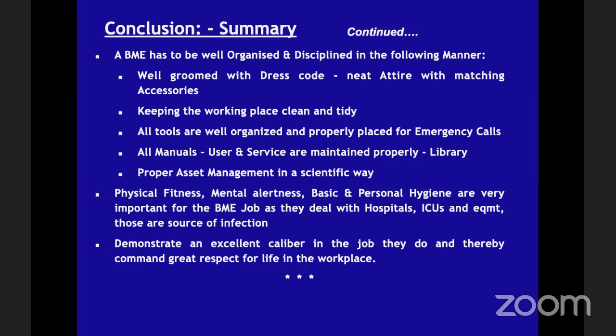Keep the workplace clean and tidy. In 90% of cases, I have not seen a tidy biomedical department. You open the department, there are cables and tubes on the floor. You have to hop around to go to the chief HOD of the biomedical. That should not be the case. All tools are to be well organized, properly placed for emergency calls. This is very important. Every cupboard should have the tools related to one particular equipment.